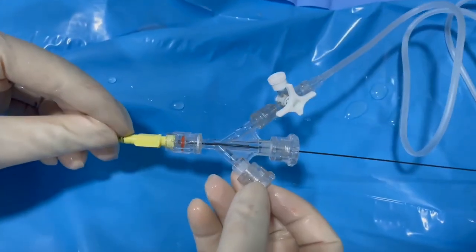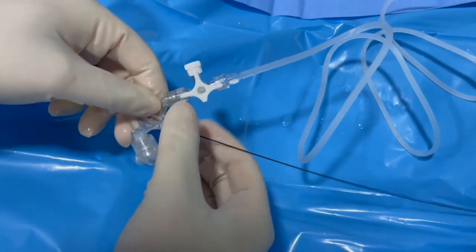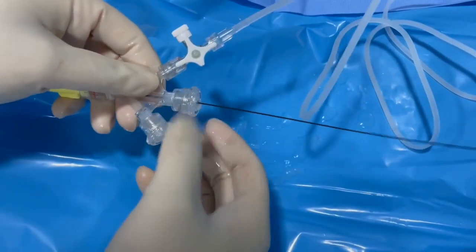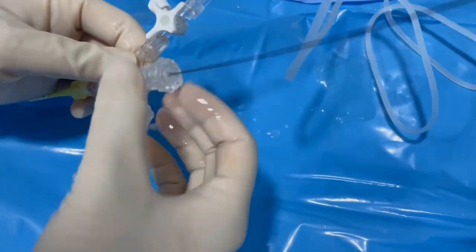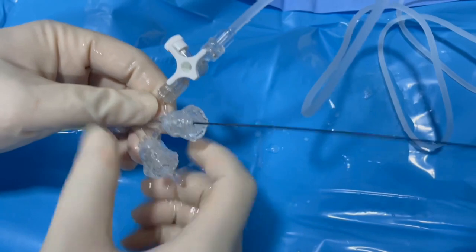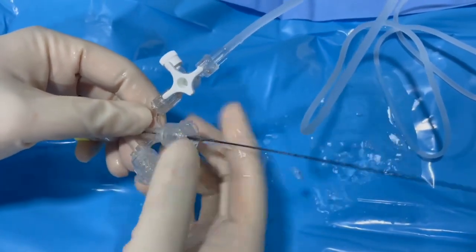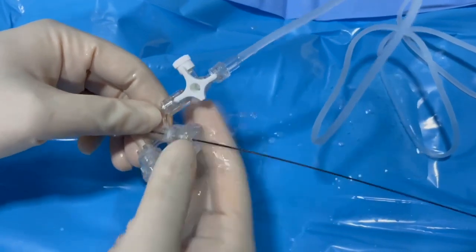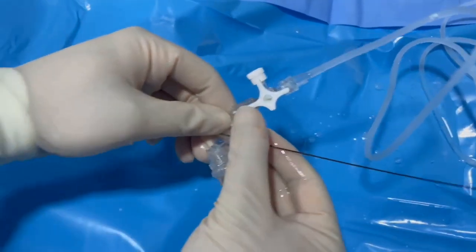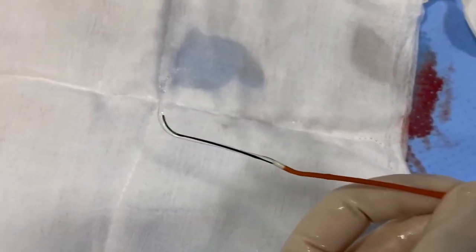Now we prepare the catheter which is to be introduced. We prefer to introduce the Envoy catheter. First, flush tubing is attached via a 3-way stopcock to the side arm of the rotating hemostatic valve, and we allow heparinized saline to run through the catheter. We ensure that the entire system including the rotating hemostatic valve is free of air. We open the other valve of the rotating hemostatic valve and allow saline to come out so that it becomes air free, and tighten the valves. Now we can see free flow of heparinized saline through the tip of the catheter. Now the catheter is ready for insertion.